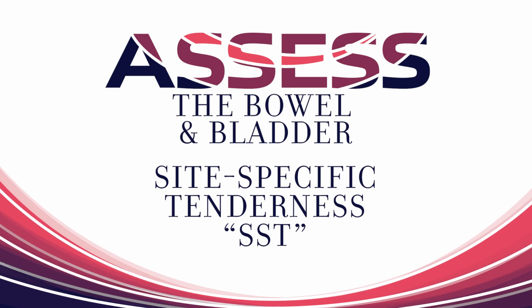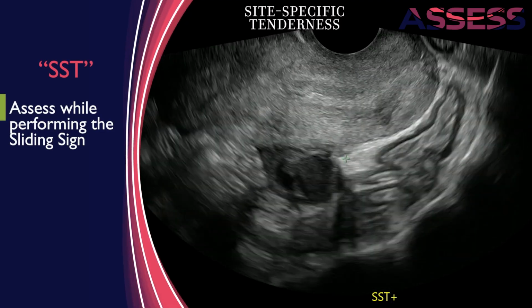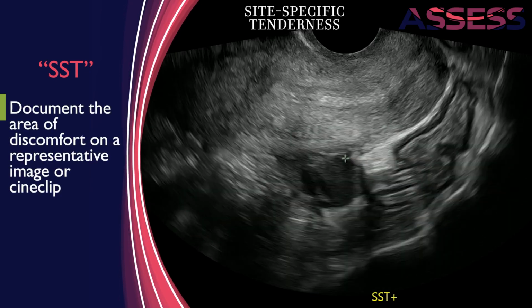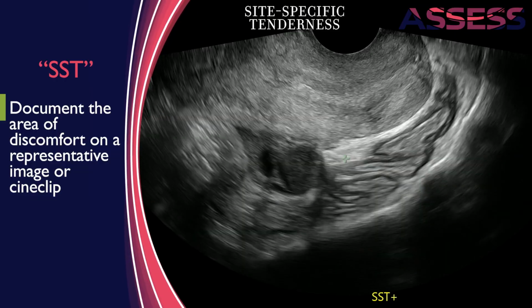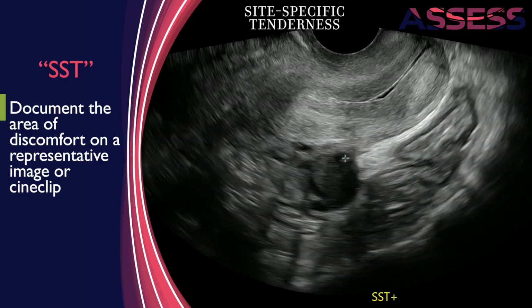Site-specific tenderness. During the acquisition of images and while performing the sliding sign, it is important to document patient discomfort. If the patient is experiencing pain or tenderness in a specific area, it can be documented with the acronym SST, short for Site-Specific Tenderness, on a representative image.